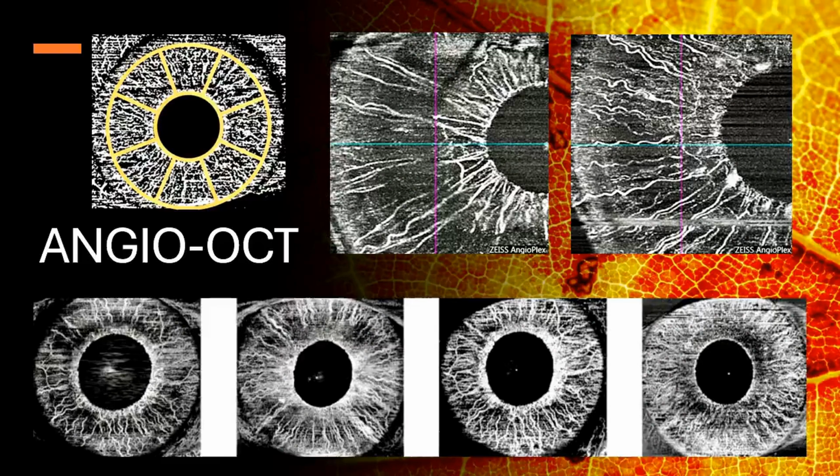Angio-OCT is a technique that, although we do not perform it routinely, can be very useful in selected cases where there is suspicion of iris atrophy due to an excessive number of laser sessions. As we can see in the upper left, we can perform a quantitative analysis of the number of vessels detected, divided into 8 zones of the iris. And as shown in the lower part, we can carry out a comparative study of the iris vasculature before starting the sessions and its evolution throughout the different phases of laser treatment.